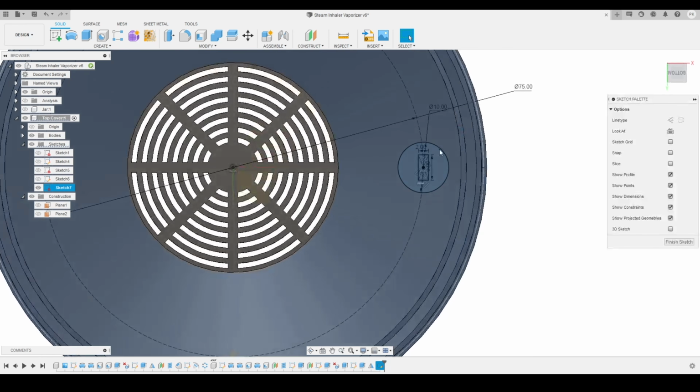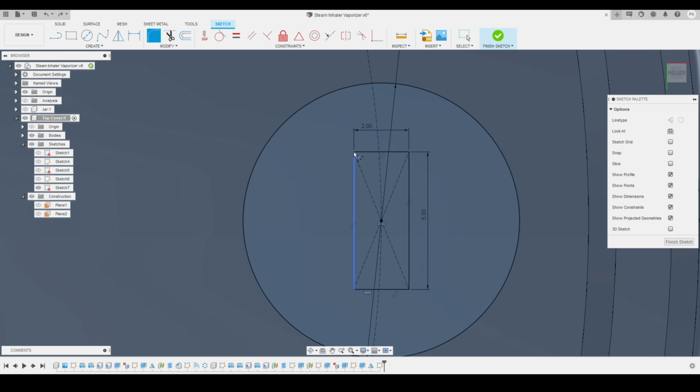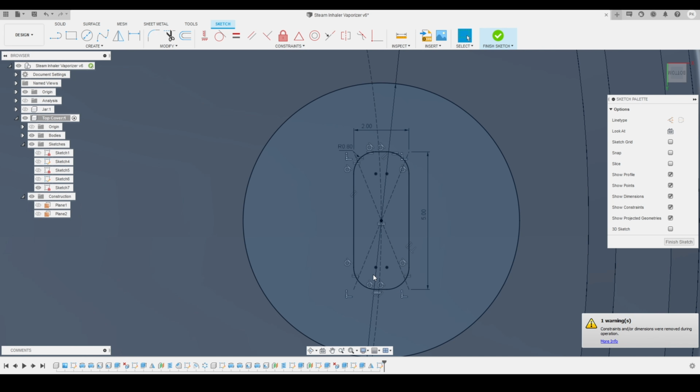So if I go back to our edit sketch, we're going to activate the fillet tool. We'll select all the corners over here. Here you can see I just want to fillet all the corners of this rectangle. So I had activated the tool, we selected all the corners, and we'll specify the fillet.